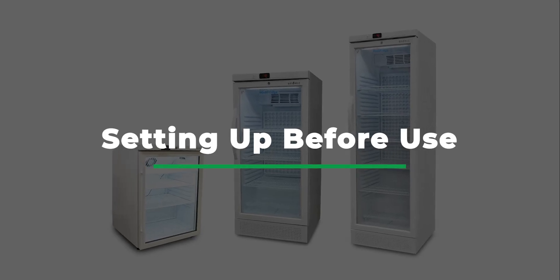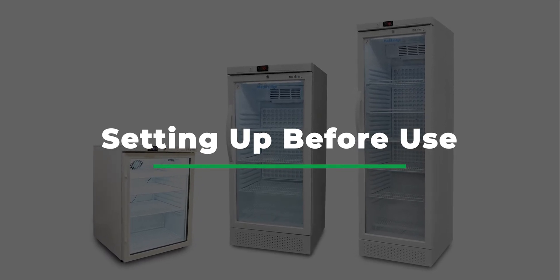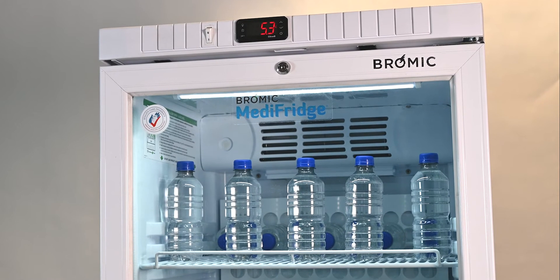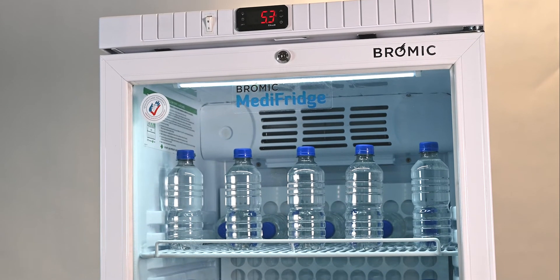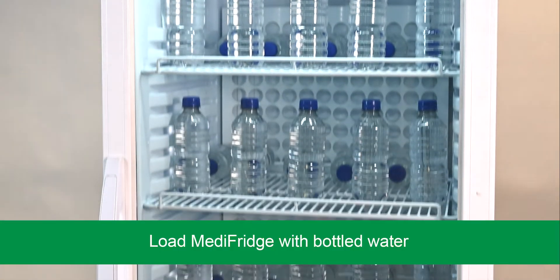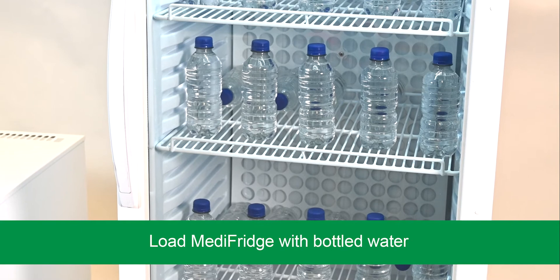Setting up before use. Bromic recommends taking steps to ensure the temperature inside your Medi-Fridge reaches the safe temperature range before stocking sensitive products. It will minimize the likelihood of the product being exposed to temperature variations. To do this, we recommend first loading your Medi-Fridge with non-sensitive products capable of holding thermal mass, such as bottled water.